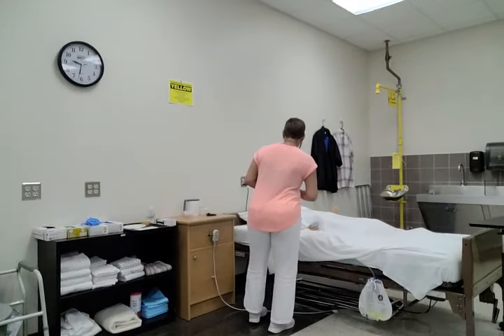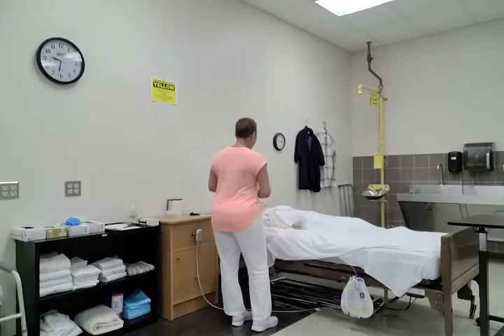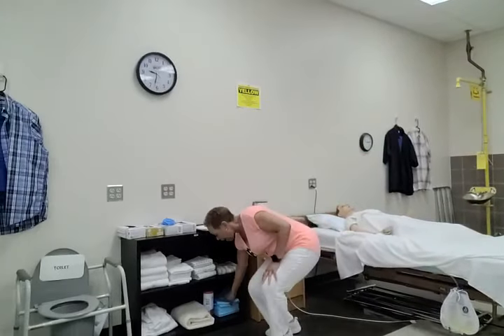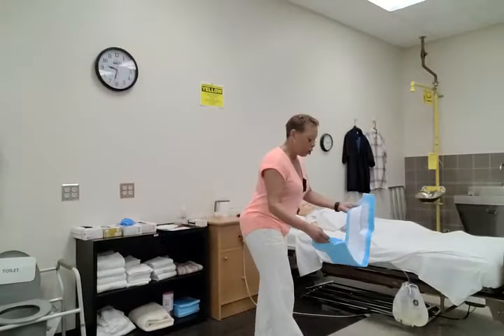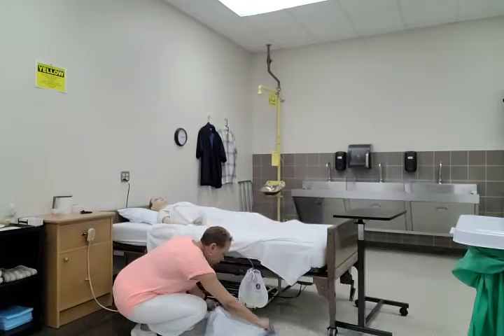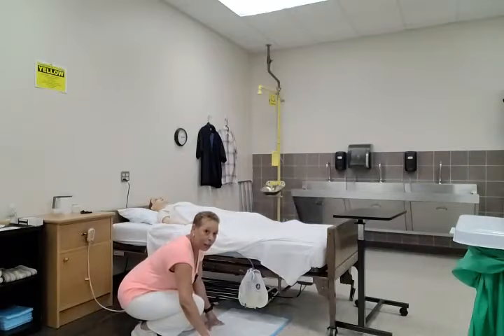Mrs. Jones, is there anything I can get for you before I go wash my hands and gather my supplies? Okay, I'll be right back. Washing hands. The first supply item I'm going to gather will be the chucks. I'm going to use it as a clean barrier by placing it on the ground underneath the urinary drainage bag.